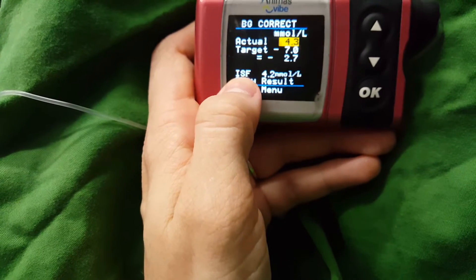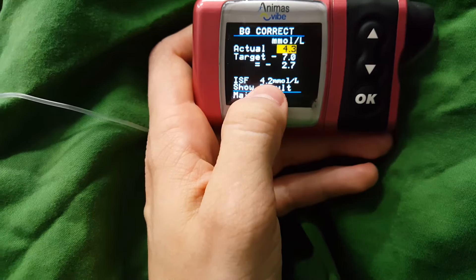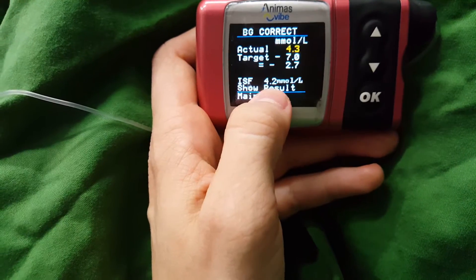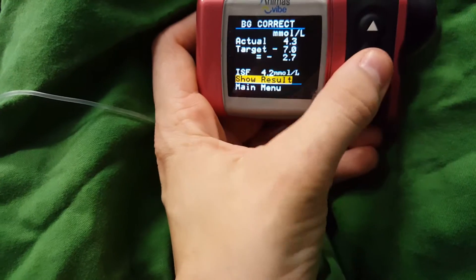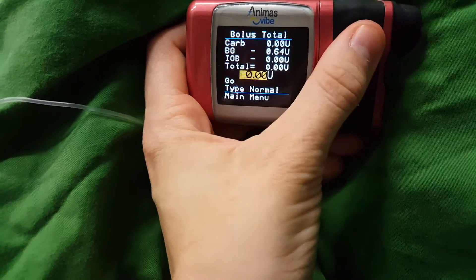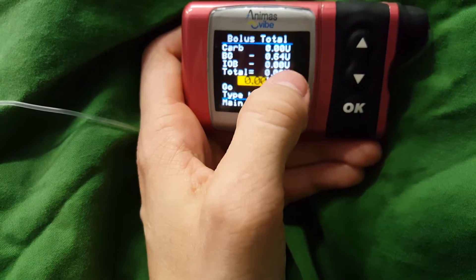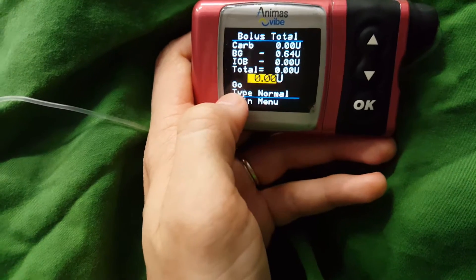This ISF means insulin sensitivity factor — so that's how much one unit of insulin will affect my glucose. It'll bring it down by 4.2 millimoles. My target is seven plus or minus 2.6 millimoles. Then you go to show a result and it will show you how much you need. You press the up arrow and it'll work it out and put it here, then you press go.